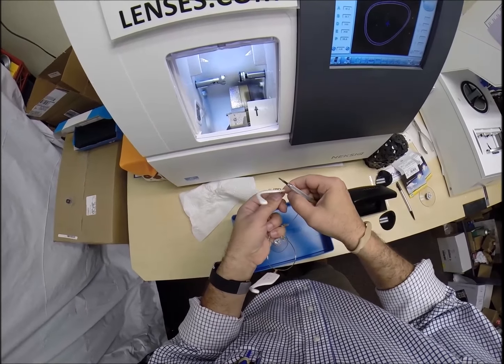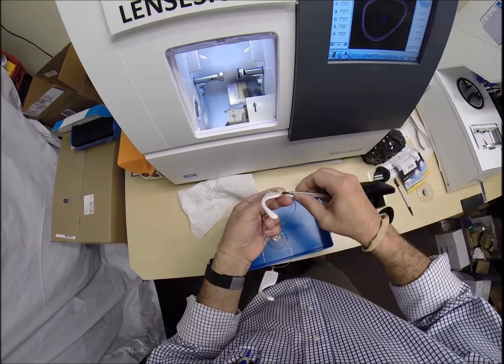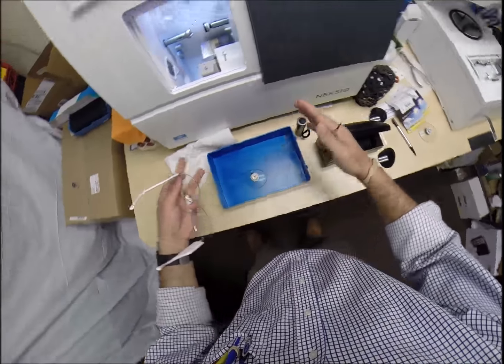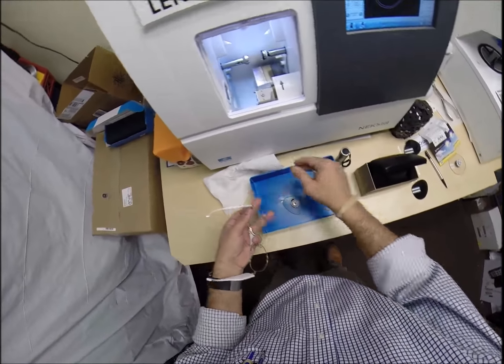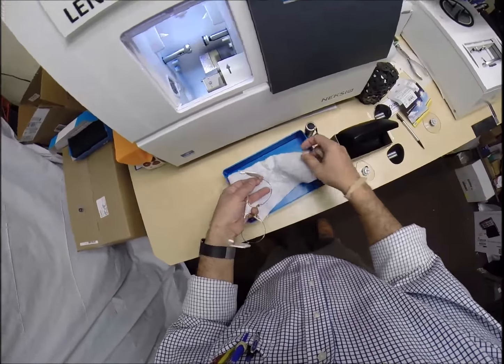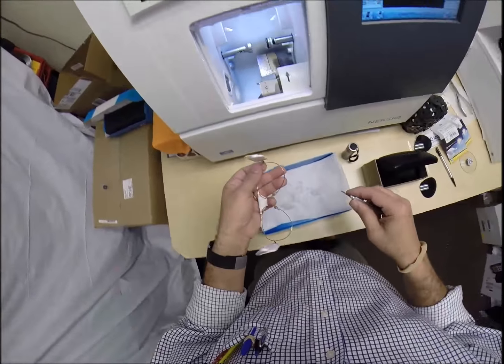I want to keep the screw in there just a little bit because of the odds of someone at home dropping a screw. I even do it here, so it happens in real life. But you can get a baking dish or a large pan or something like that, a box. Put a t-shirt in it. I'm using a paper towel so I don't have to take my shirt off, because nobody wants to see that.